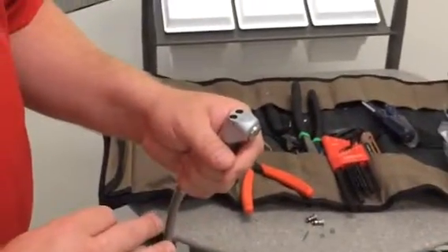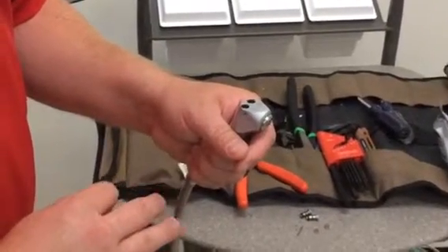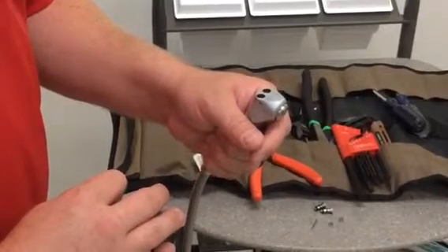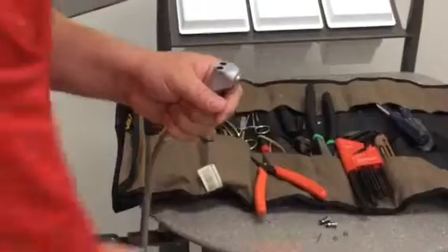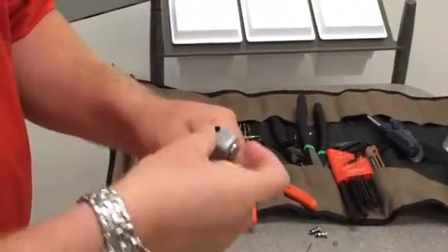For this style of syringe, even though it may call for another part, I like to use 8X syringe buttons. The part number for that is 23.1234.00. They're made very well, and they're a little bit more ergonomic. So, you don't have to replace the spring every time, but if you have it, it's a good idea.